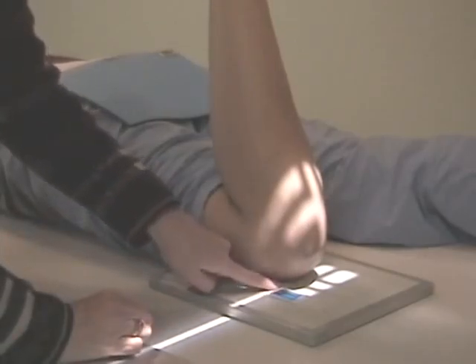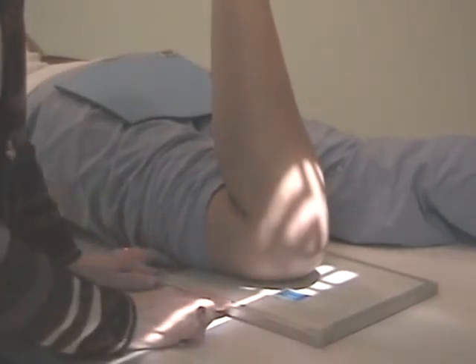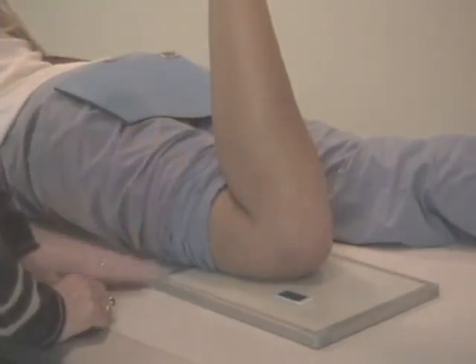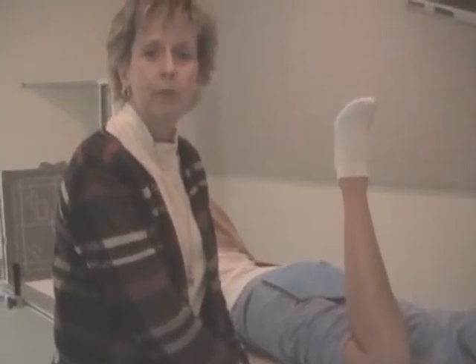And you're exiting to the same level. See how I'm into the depth of the patella, coming right into the joint space there. And I want to exit to the center of the cassette, here and here. Tight collimation, leg straight, and the tube at 40 inches. And that would be another alternative to the patella. When you're evaluating this radiograph, you want to have the patellofemoral joint space open.